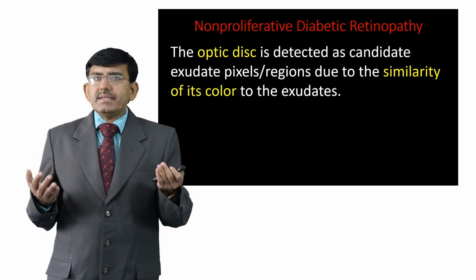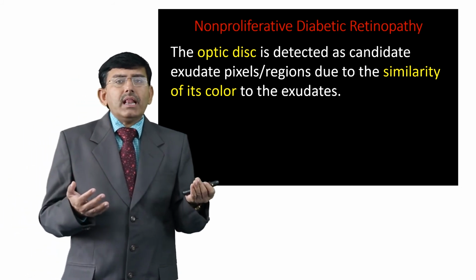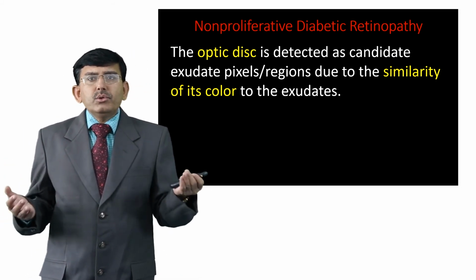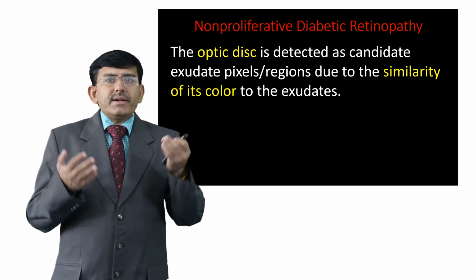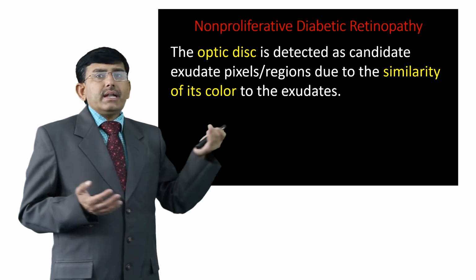The optic disc is detected as a candidate exudate pixel or region due to the similarity of its color to the exudate lesion.